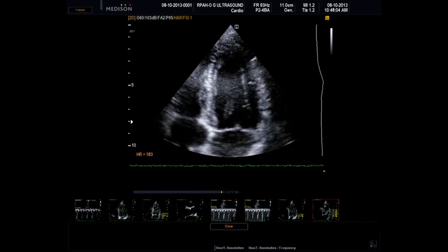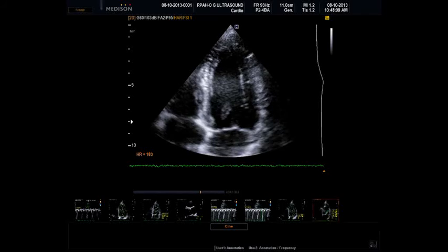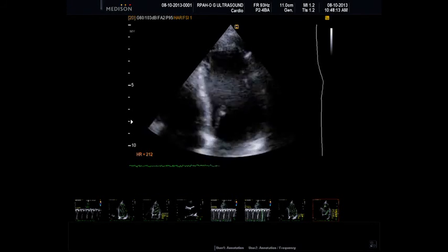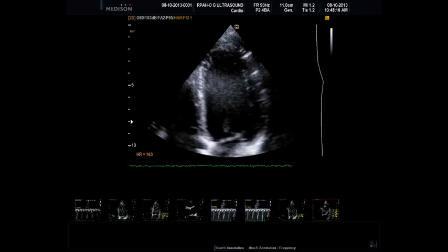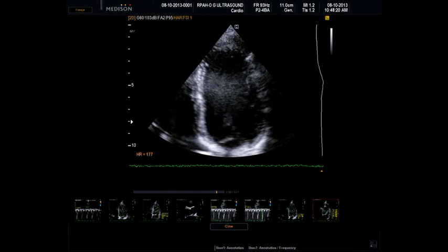So basically, it's quite simple. It uses the summation of discs, so you'll see. We all sort of feel it's a rough estimate. We don't routinely use it scientifically; you do it from an eyeball perspective to get a figure.